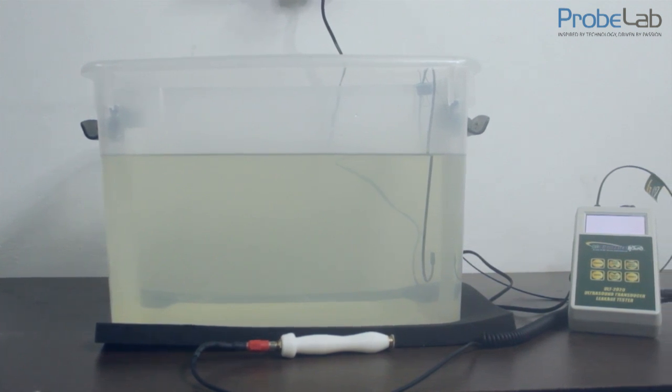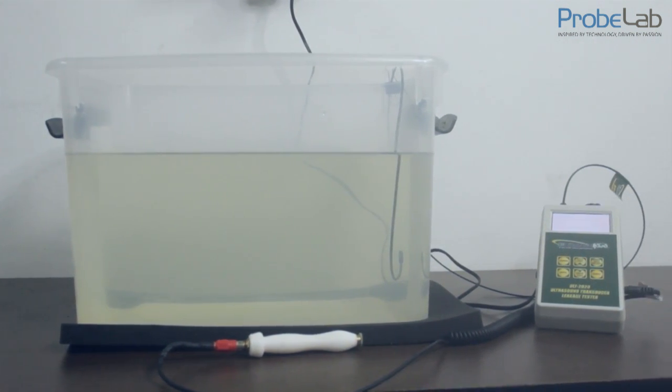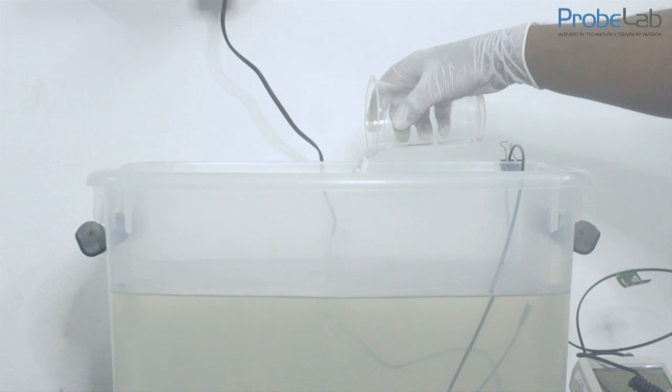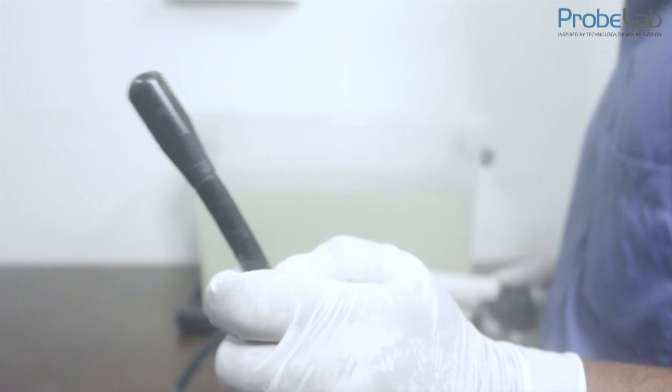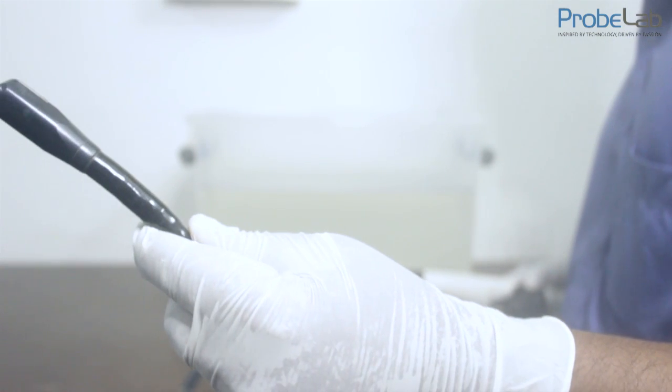This video is about the leakage test of a TE probe. First, add the appropriate amount of saline solution to the water for conductivity. This is the TE probe which we will conduct the leakage test on.